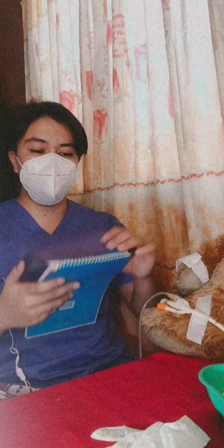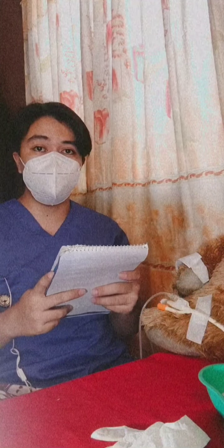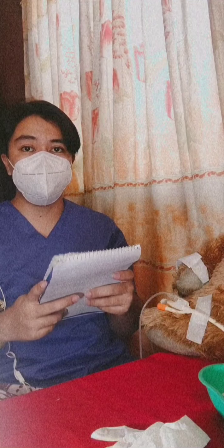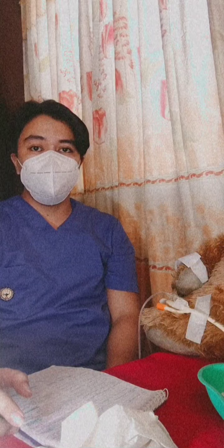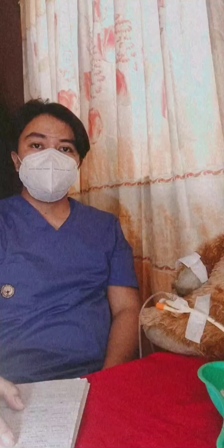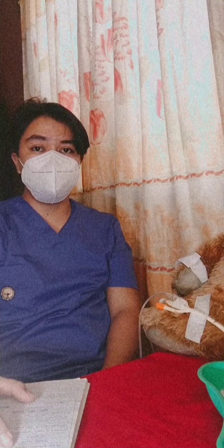Next, we need to review the patient's medical record and check the physician's order. And then also, we need to review the intake and output record of the patient. For planning, we need to develop an individualized method of care for the patient. Next, we need to gather all the equipment needed for this procedure.